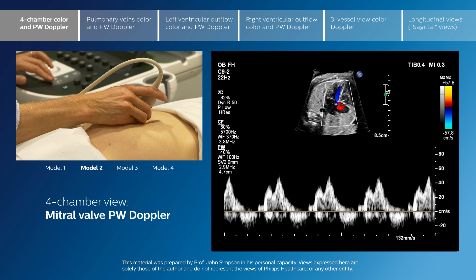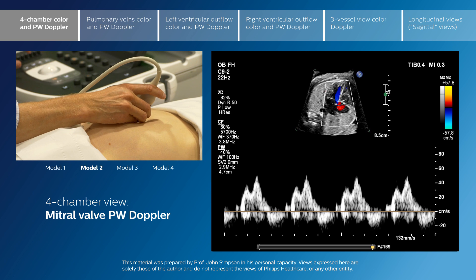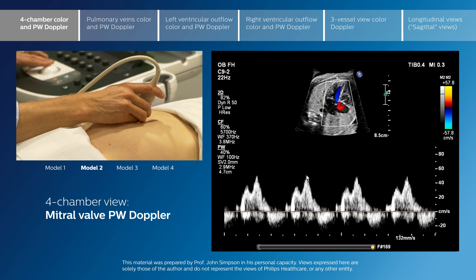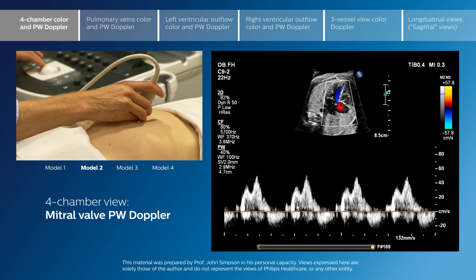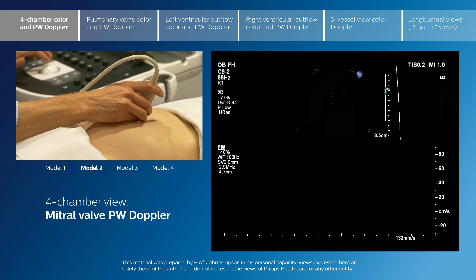What we are seeing is the normal biphasic inflow pattern across the mitral valve. The E wave — this early phase of filling — is slightly lower velocity than the A wave. This can change with gestation as the E wave velocity tends to go up with advancing gestation while the A wave is much more constant. There will be a more prominent E-to-A ratio in later gestation, and a more dominant A wave compared to the E wave in early gestation. But E velocity less than A is a normal finding during fetal life, in contrast to the situation postnatally.